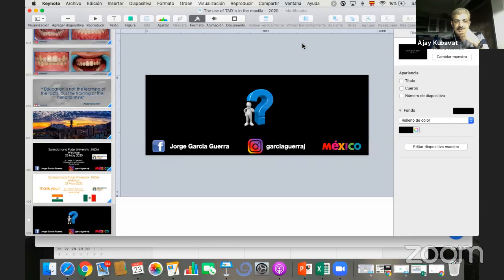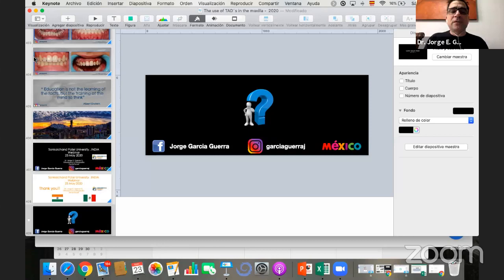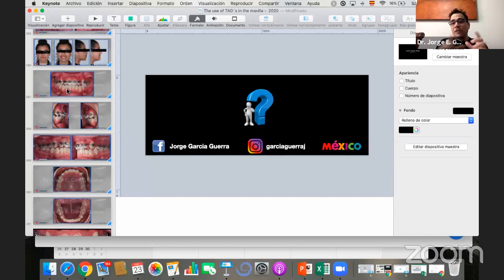Should the length of the lever arm be reduced as the canine reaches occlusion? Sorry, what's the question? Would you be reducing the length of the lever arm? Oh yes, sometimes you reduce the length of the lever arm. You can reduce it. And an important thing: sometimes when you're activating the chain, if the chain doesn't have any more room, you can't do any more activations. What you can do is take a three-prong, you know. Three peak, how do you call it?